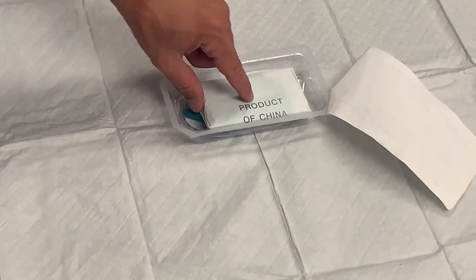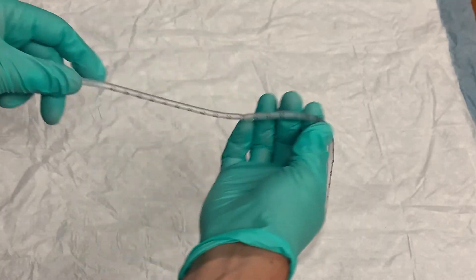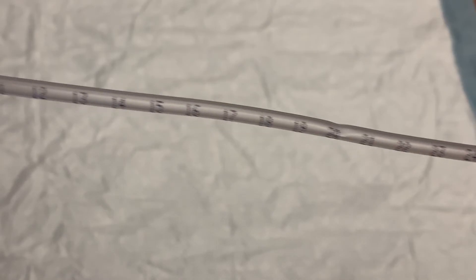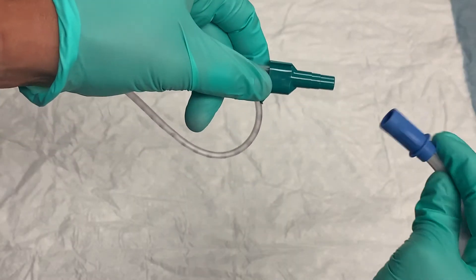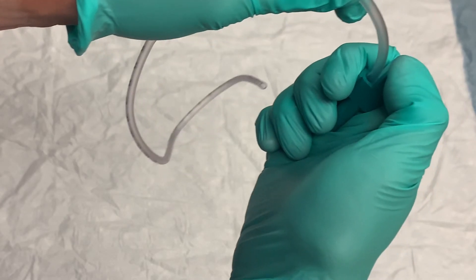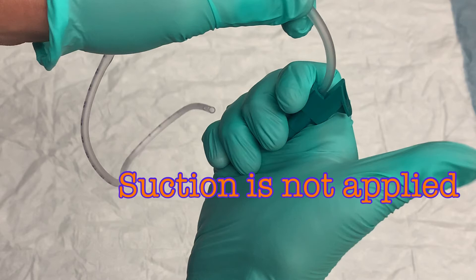Now open the suction kit and don the sterile gloves. Remove the suction catheter — it can be inserted up to 40 cm, though that will not commonly be needed. There are centimeter markings visible along the length of the catheter. At the end is a green adapter with a Christmas tree end that will be inserted into the suction tubing. There is an open port or hole on the adapter — this is how you will control whether suction is being applied. When the port is covered by your thumb, suction will be applied through the catheter; when uncovered, negative pressure will not reach the end of the catheter, so suction will not be applied.